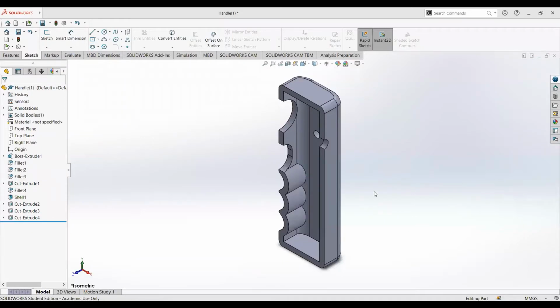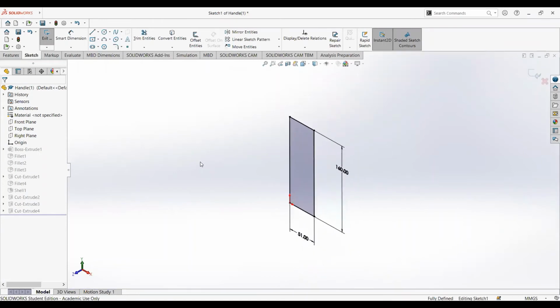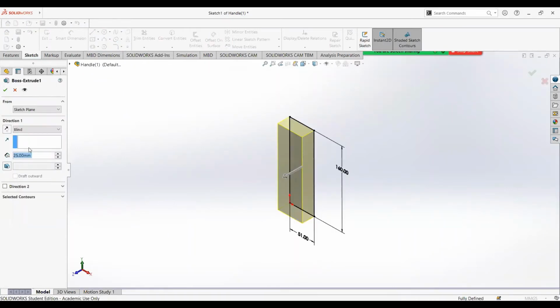So this is our handle, like one of the shells for our handle. This is one side, and we created exactly the same dimensions, everything, for the other side as well, but it was created in a different plane, which I'll show you after explaining this part. So first we sketched this, and we're going to boss extrude that part right here by 25 millimeter.